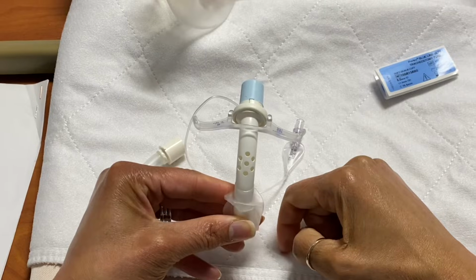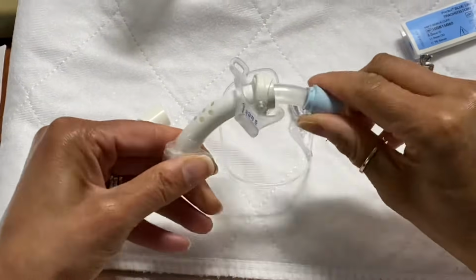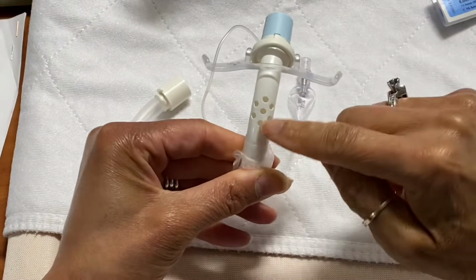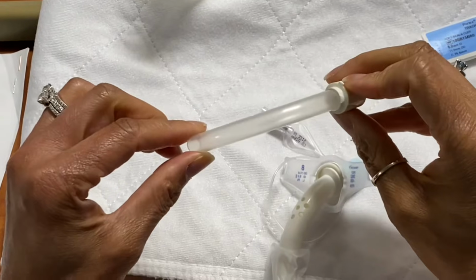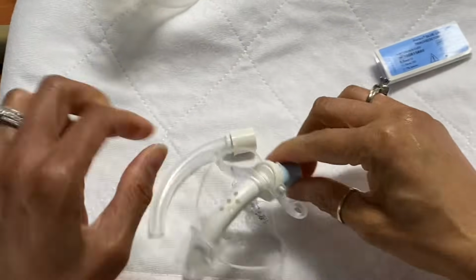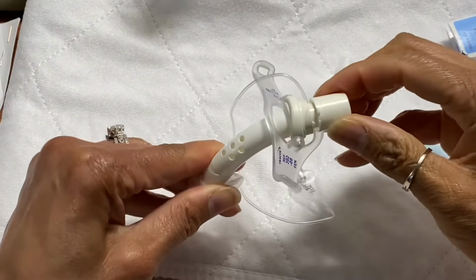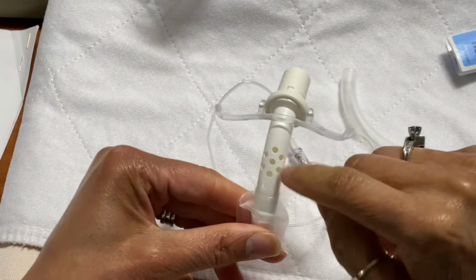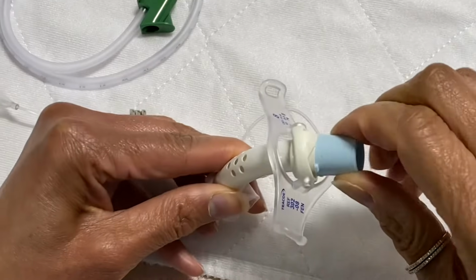These are the fenestrations here on the Tracoe, on the trach itself. So once you put in the fenestrated inner cannula, it matches up with where the holes are on the Tracoe, so that there's an opening there. This is the non-fenestrated inner cannula. Again, this is non-disposable. It's cleanable, just like the fenestrated one. And again, you twist, you remove the inner cannula, and you replace the fenestrated inner cannula with the non-fenestrated, which blocks the holes on the Tracoe, the fenestration here, so that the air just goes directly into the trach and into the lungs.